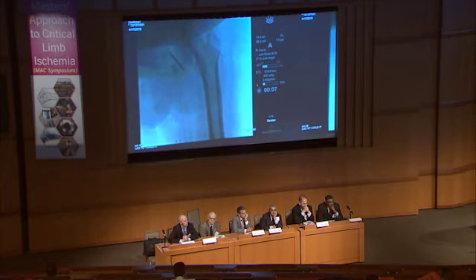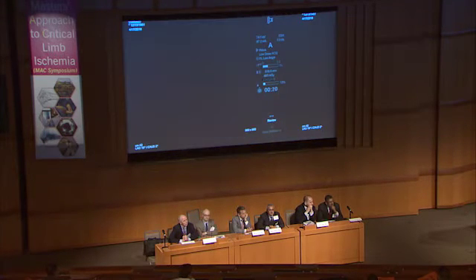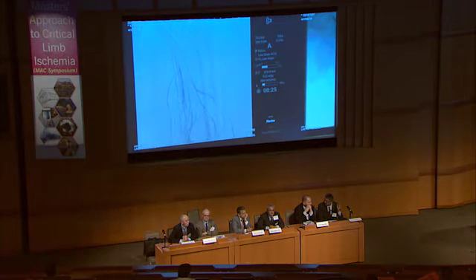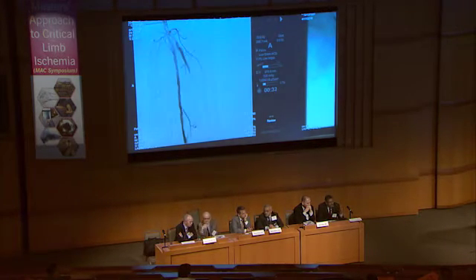So I just wanted to make the case that although this case may be one that nobody sees during their career, the whole concept of this steal from an artery to a vein is really important to keep in mind when you're doing critical limb cases. So one of the scenarios that can happen is if during a popliteal puncture, for example, you induce an AV fistula, and you have tibial disease, you'll also induce steal, and you'll also make things worse.